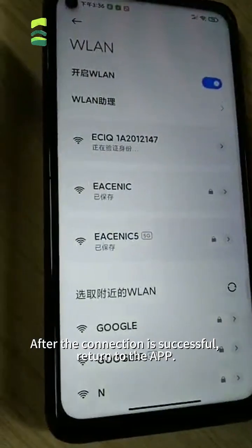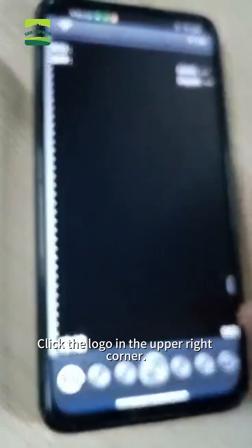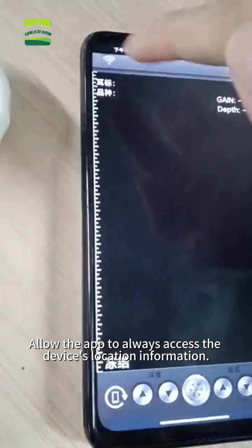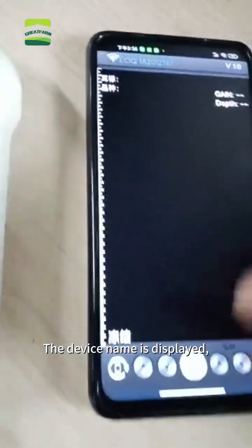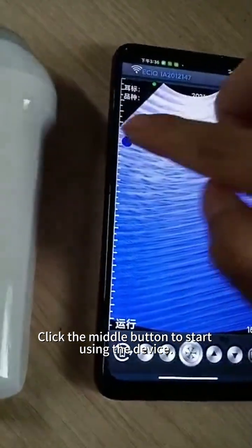After the connection is successful, return to the app. Click the logo in the upper right corner and allow the app to always access the device's location information. Click the logo in the upper right corner again. The device name is displayed, indicating a successful connection.